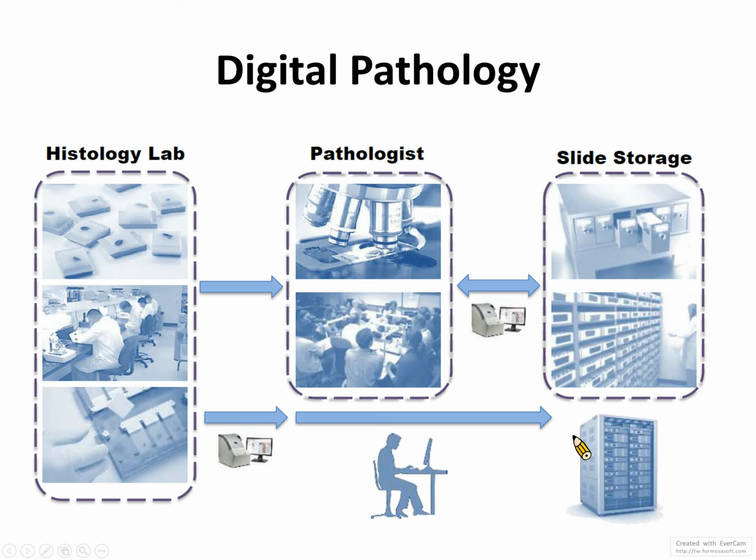So in digital pathology, the first thing is that you need to digitize everything on the pathology slides. One of the advantages of digitizing these slides is that the color of any pathology slide will fade in the long run, as time passes.